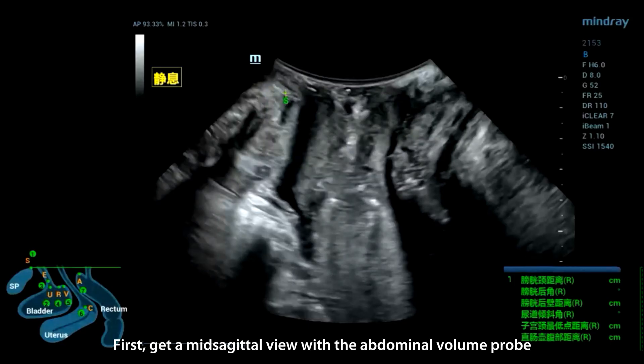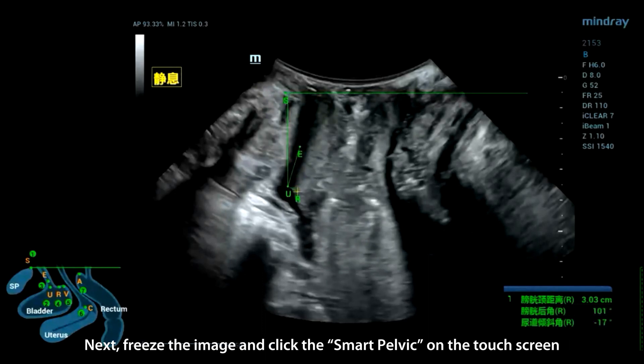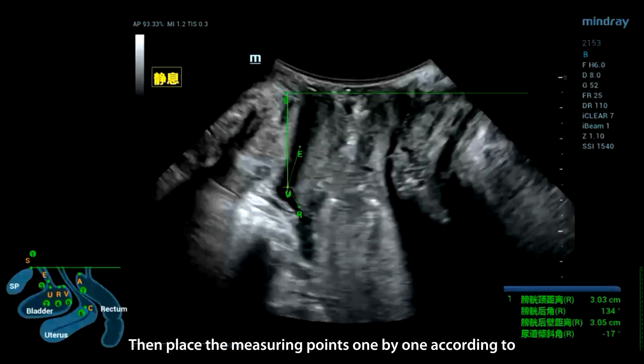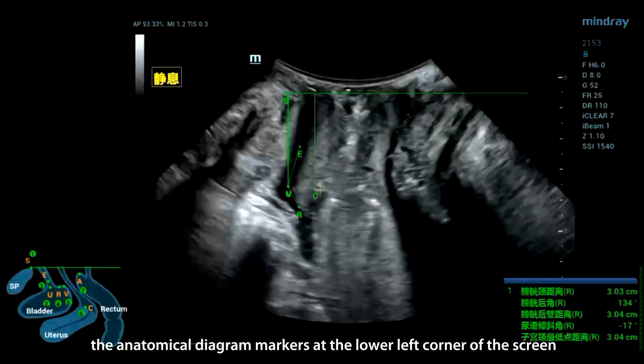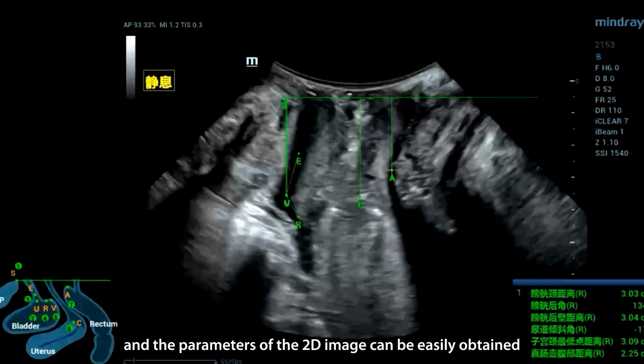First, get a mid-sagittal view with the abdominal volume probe. Next, freeze the image and click Smart Pelvic on the touchscreen. Then place the measuring points one by one according to the anatomical diagram markers at the lower left corner of the screen, and the parameters of the 2D image can be easily obtained.